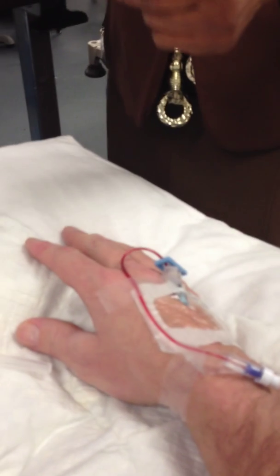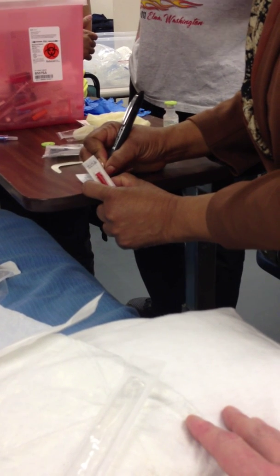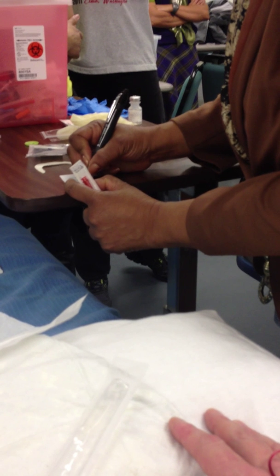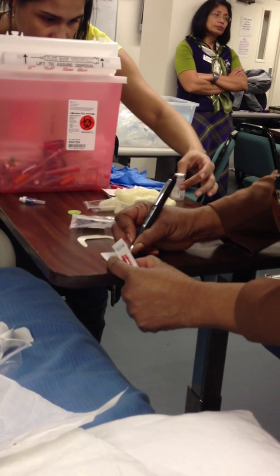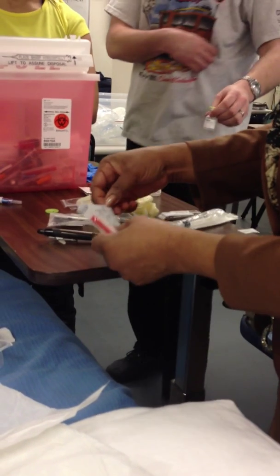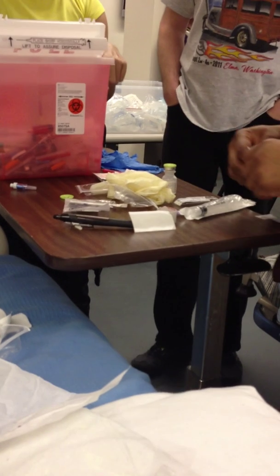I'm going to put this name. You can also do the catheter with the extra tubing in there for the dressing, but I dated in time with the dressing that came with it. What's your last name? Rice — R-I-C-E. I'm going to put the medical record number: one, two, three, four, five. I'm going to put my initials, and the time that I drew this specimen. Time is 1448. Now I need to label the specimen and put it in our lab bag and send it down to the lab. You'll need to do that step for check-off, so you can do it a separate stick, or it's easier to start an IV on a patient and draw that blood at the same time.